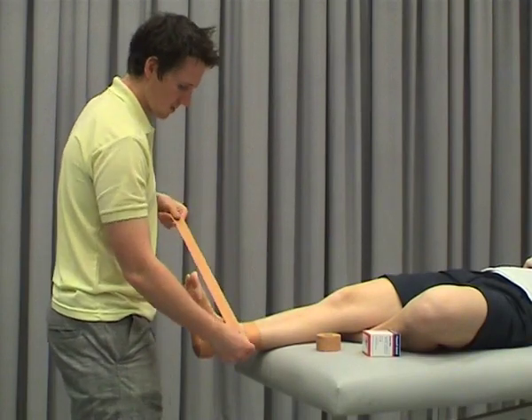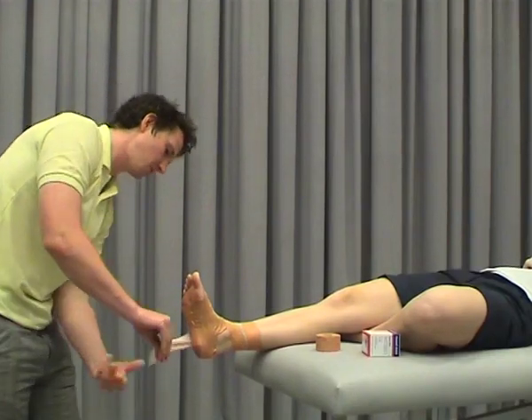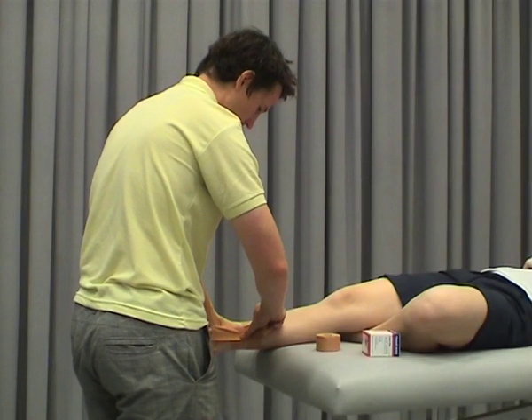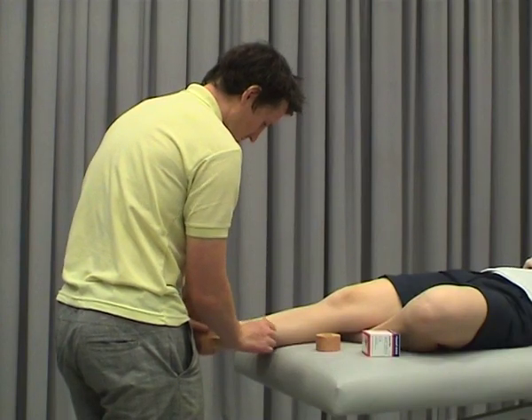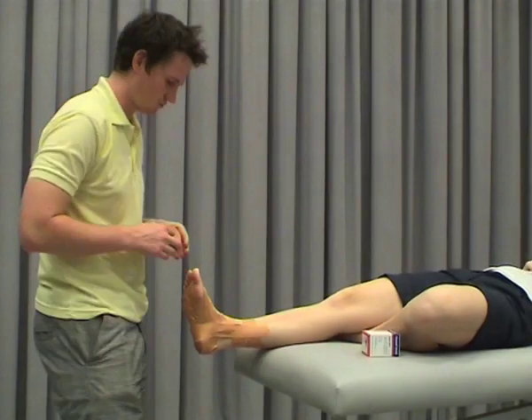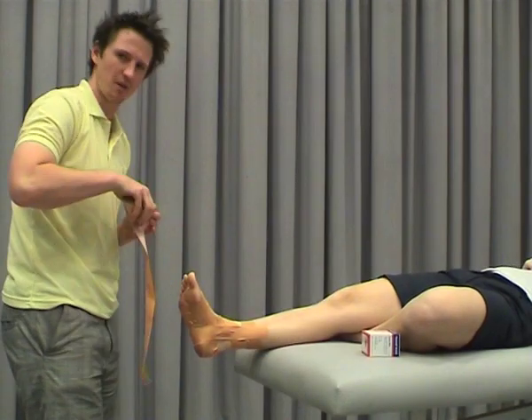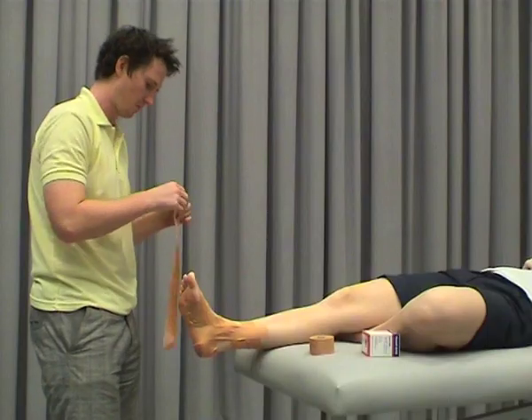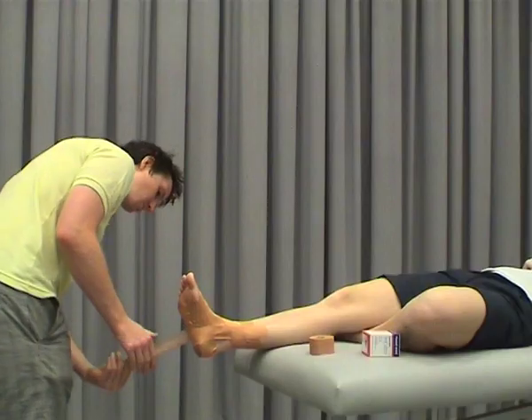Start from medial, coming obliquely across the front of the ankle, come up and under the heel, then up through the arch, trying to capture the navicular so we can pull it up. This is giving us a lot of arch support. You can do anywhere between two and four of these depending on how much control you want, how flat the foot is, how much weight the person might be carrying — all of these impact how many strips you might need. So we'll just do two for demonstration purposes.